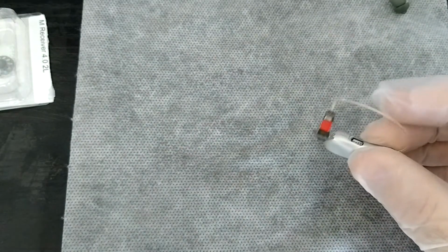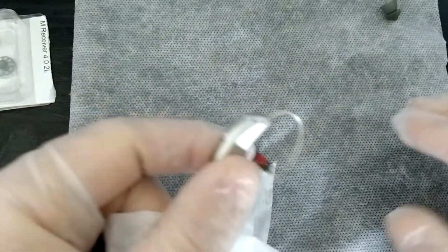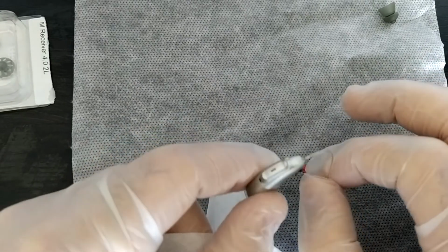Then give it a clean at the end if you want. Make sure your microphone ports are clean. That's fine. In another video we'll show you how to change the receiver itself if you need to get it changed.